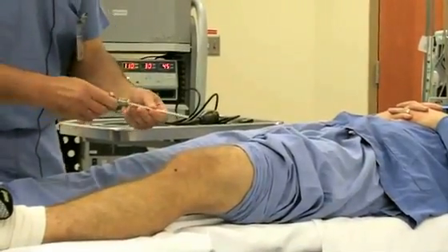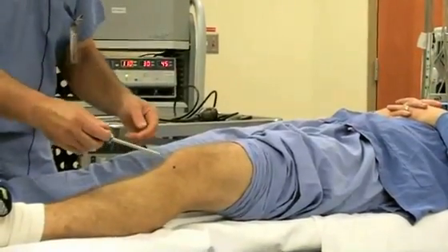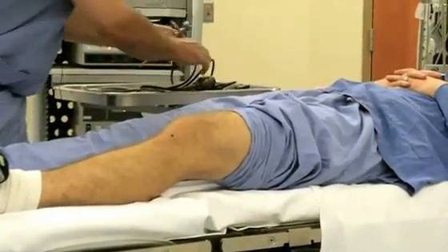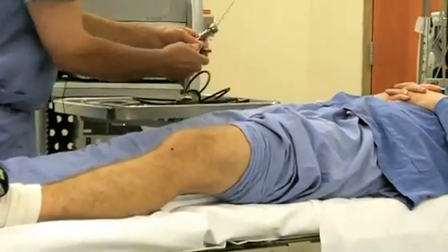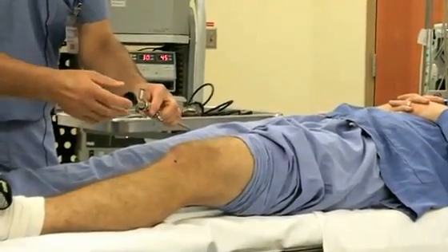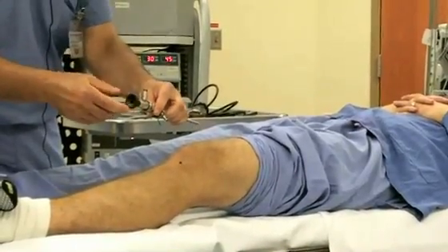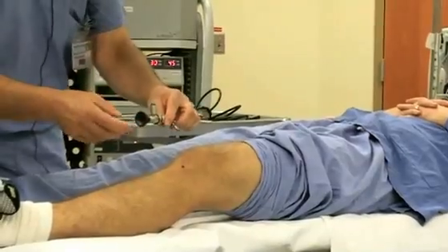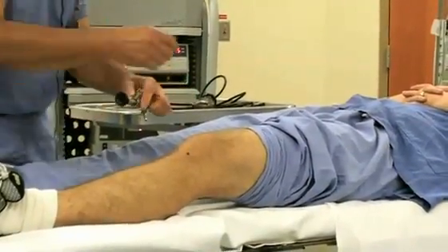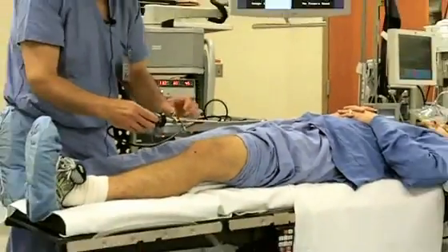This is the arthroscope sheath. It also has a trocar in the middle. The sheath is placed into the knee joint. The trocar is removed and the arthroscope is placed into the sheath. In the old days orthopedic surgeons used to look directly into the arthroscope to visualize the knee joint, which had its problems with contamination and difficulty of getting your eye down to the level of the knee. So there's been tremendous improvements in that area and we now use a video camera that attaches right to the arthroscope.